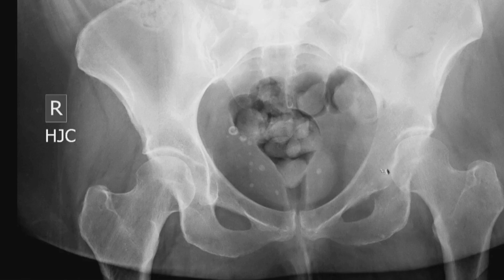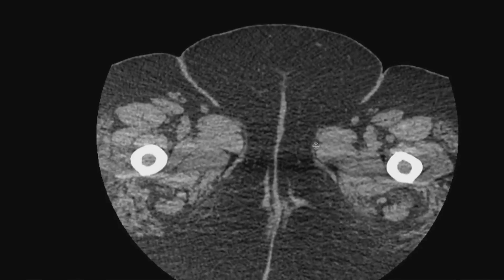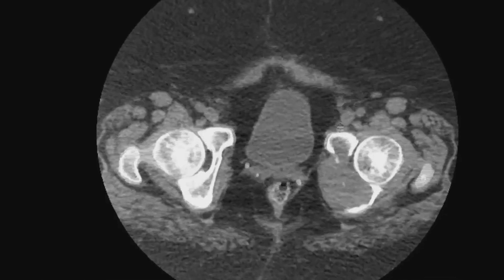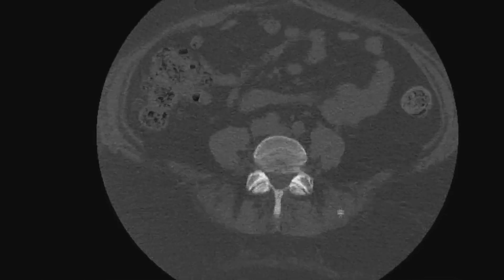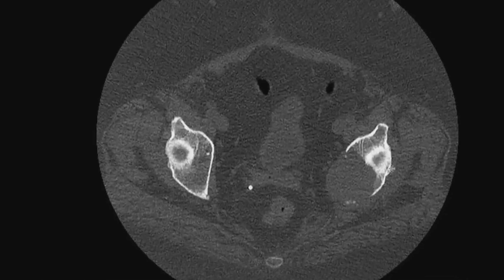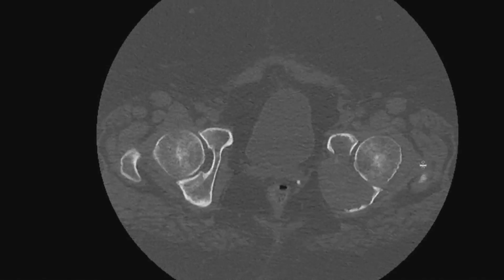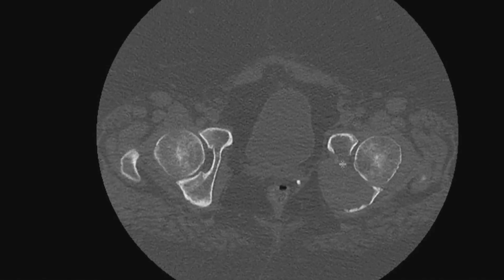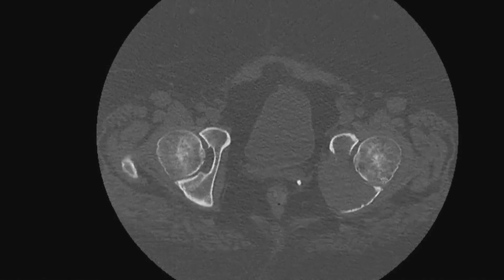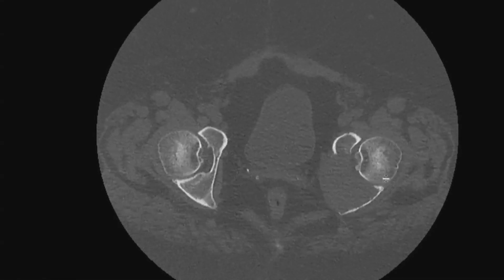In this case, the tumor was metastatic lung cancer. A follow-up CT, which was not available on the simulation, shows the tumor and its location predominantly in the posterior column of the acetabulum.